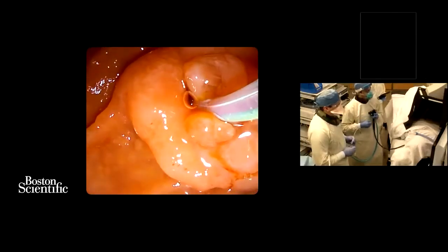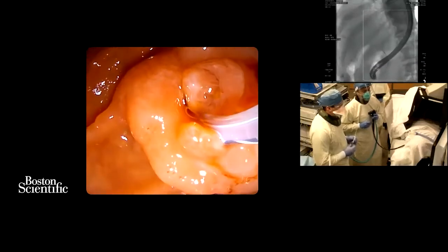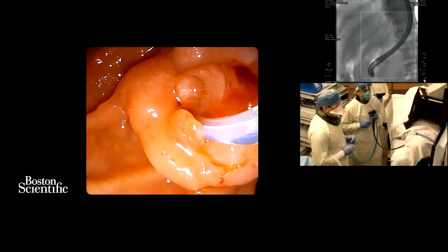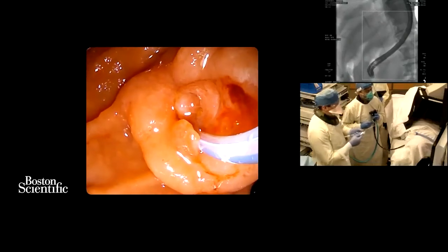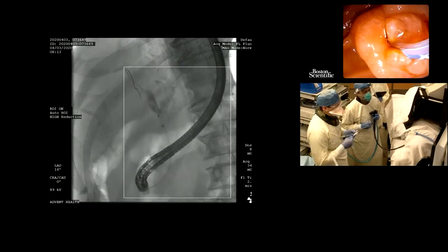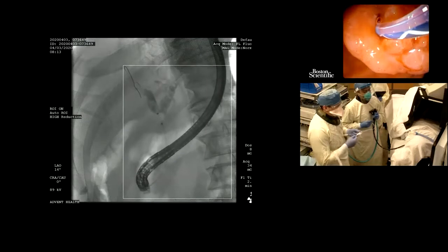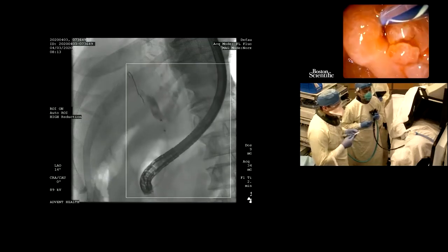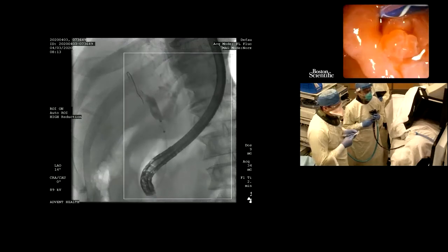So now let's go to fluoroscopy. And now Enrique is advancing the guide wire past the biliary stricture, and he's in the right system. So once we are down, we are going to inject some contrast. Let's inject contrast, Enrique. We're going to pull down. Beautiful. Can we have the balloon up, Enrique, a little bit? Okay, that is my balloon at the liver hilum. We are trying to get a road map of how the stricture looks. I'm going to slowly pull back.